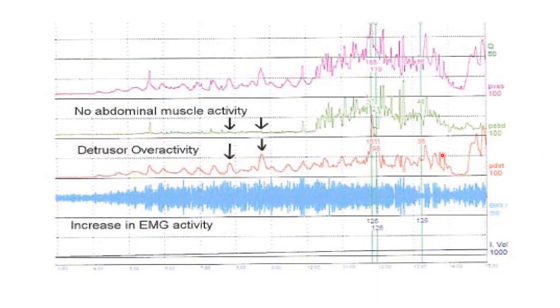In this slide, there is no rise in detrusor, abdominal, or vesical pressure during the filling phase. However, there is a slight detrusor contractility — detrusor overactivity — during the filling phase, but with no leakage. When overactivity is present with no leak mentioned, this is the graph of detrusor overactivity only, without urge incontinence.